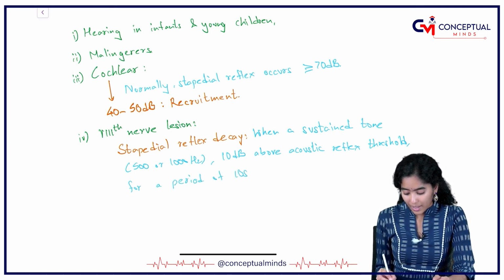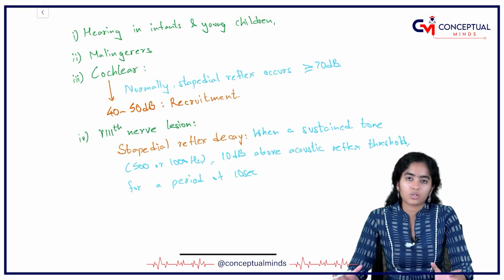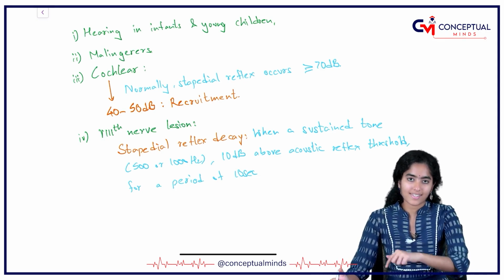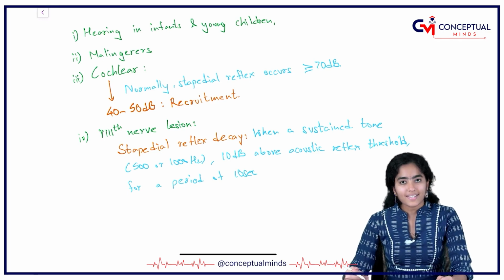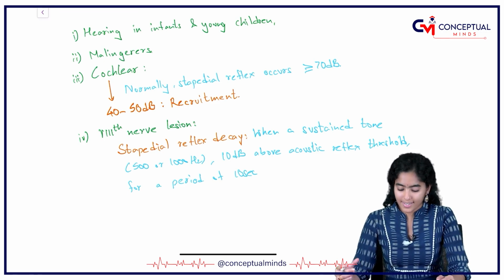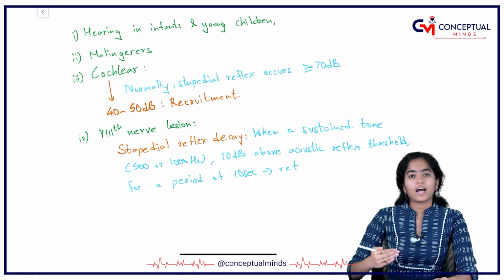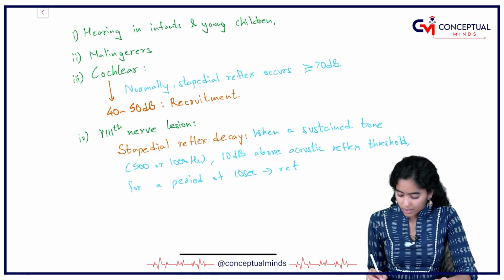Now when it is well above the acoustic reflex threshold, what should the stapedius muscle do? It should contract, because the eighth nerve will sense it and send the signal. Stapedius will contract. But this eighth nerve, which is diseased, what it will do, if you send the same sustained tone for a period of more than 10 seconds, it will bring down the amplitude of the reflex to 50%.